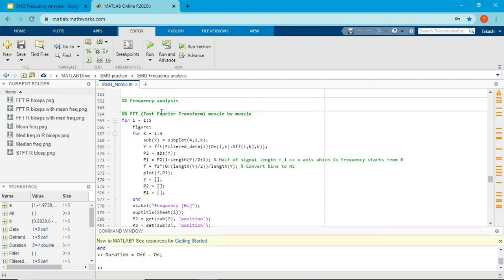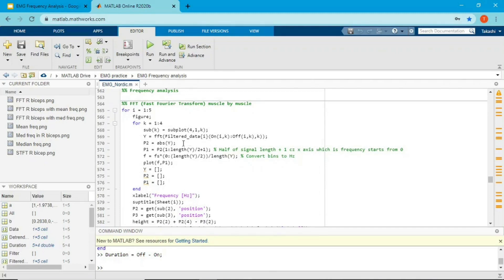Now I'll start frequency analysis with FFT. The function I'm using is FFT — the input argument is filter data, and I define the muscle activation using on and off indices. The FFT function returns a vector and I rectify the output, saving all values into a variable called P2. This is double-sided, meaning frequency appears on both left and right sides — essentially mirrored.